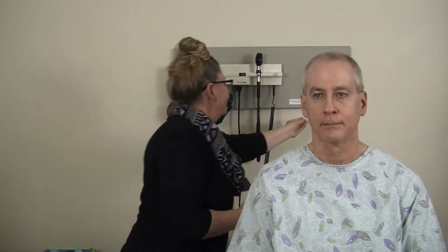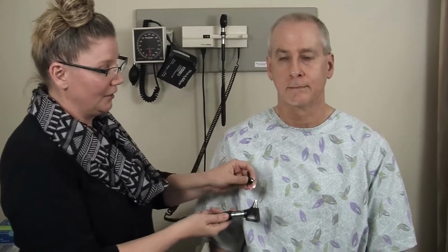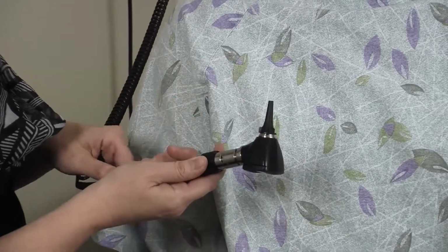The next part of the exam is I'm going to be using an otoscope to look inside the ear. What I'm going to be looking at is the ear canals and the tympanic membrane. A couple of notes on the otoscope: it's a light, and you can either make it brighter or dim. You're going to want it as bright as possible to look in the dark areas of the ear canal and also when we do the mouth exam. The speculum, you can put on the top and twist counterclockwise until it clicks into place. And then you're set to go.